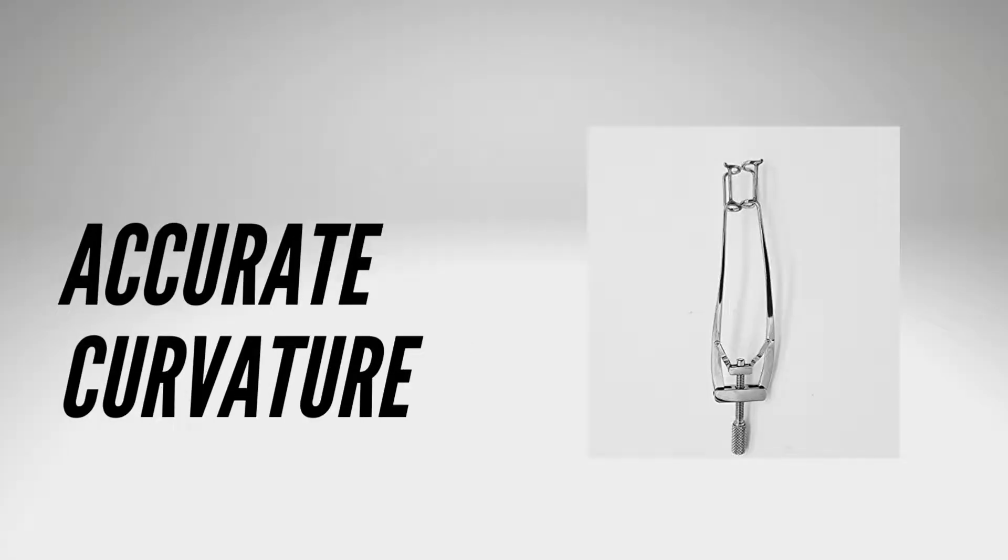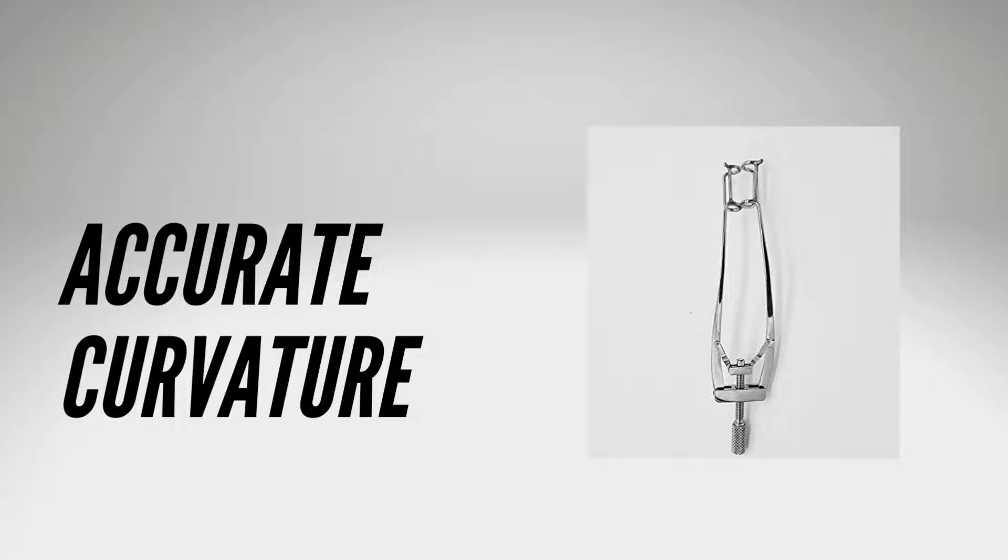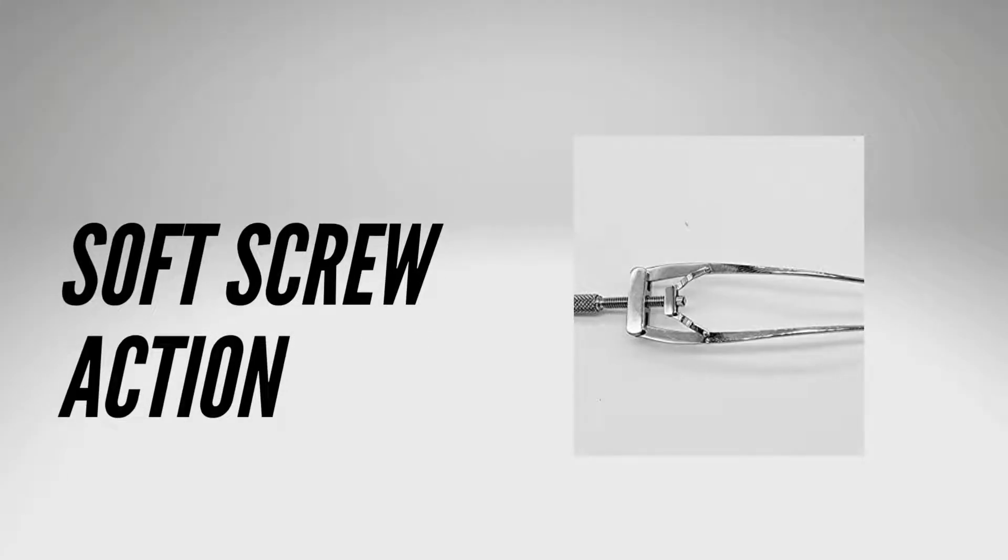The curvature of the blades corresponds to the orbital anatomy, allowing lid opening without exerting pressure on the globe. The soft spring action protects the eyelid from excessive stretching and injury during surgery.